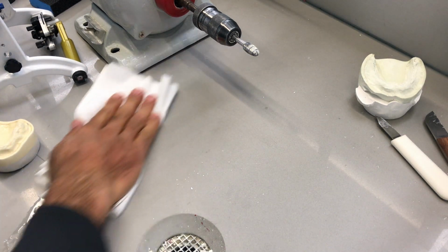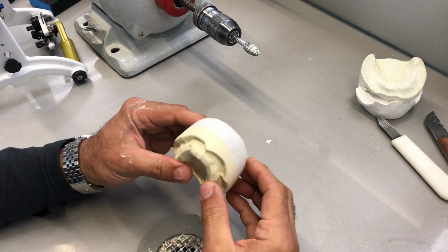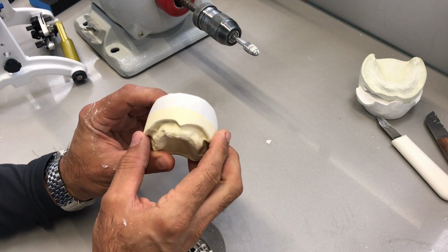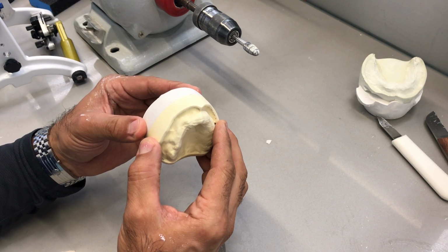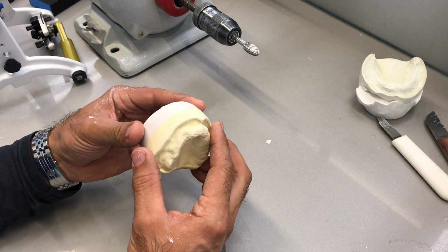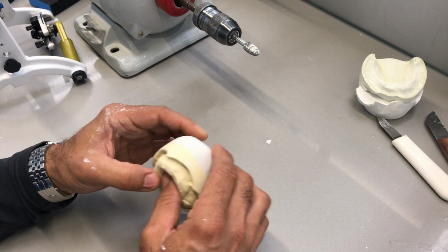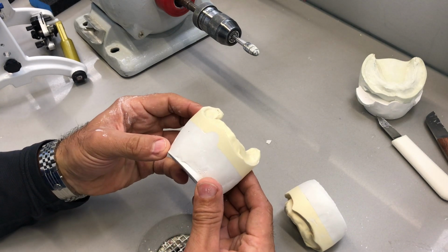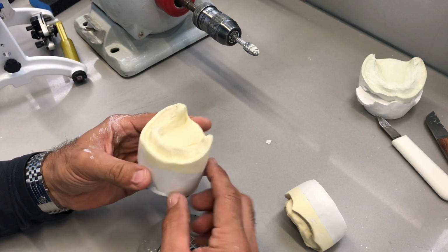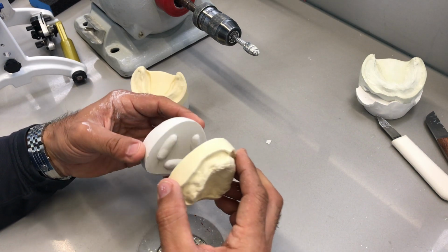So now let's take a look at those mountings and talk about the importance of keyways. So here's the upper once again. Looks pretty good, but remember, this is not secured because it's separated already. But when I put it back together, it gives me a very nice visual of how it fits back together. You don't want this to happen after you mount. What you want to happen is this. The model's still secured on the mounting itself. But sometimes, because you're using hot water and you boil it off, it does separate. Okay? If it does, we have to secure it back onto the mounting.